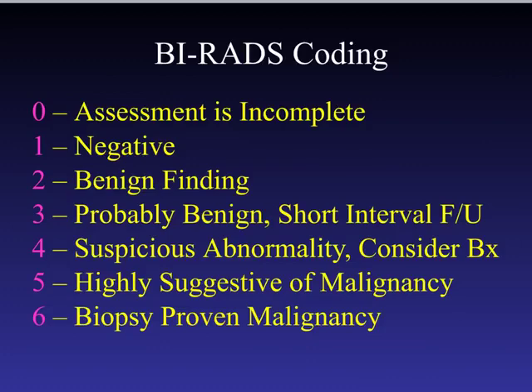Within the BI-RADS 4 category, we have 3 subcategories, BI-RADS 4A, BI-RADS 4B, and BI-RADS 4C, which indicate how worried we are about that finding. A BI-RADS 4C means that we are very concerned that the finding is a cancer. A BI-RADS 5 is one step up, which, by definition, the finding is highly suggestive of malignancy. The recommendation for BI-RADS 5 lesions is often biopsy as well. However, the patient may go to surgical excision or have additional imaging performed at that time.